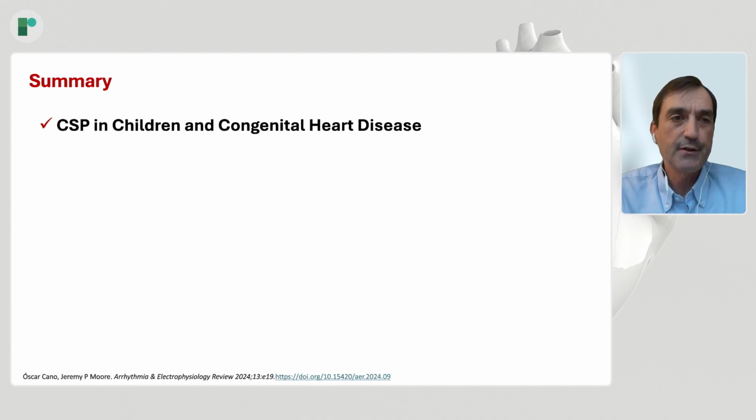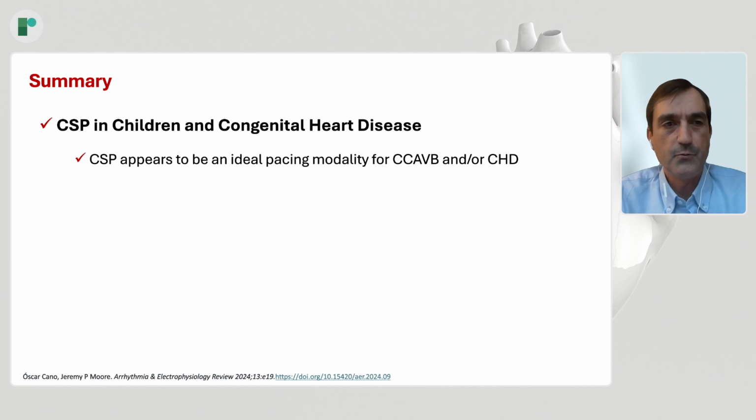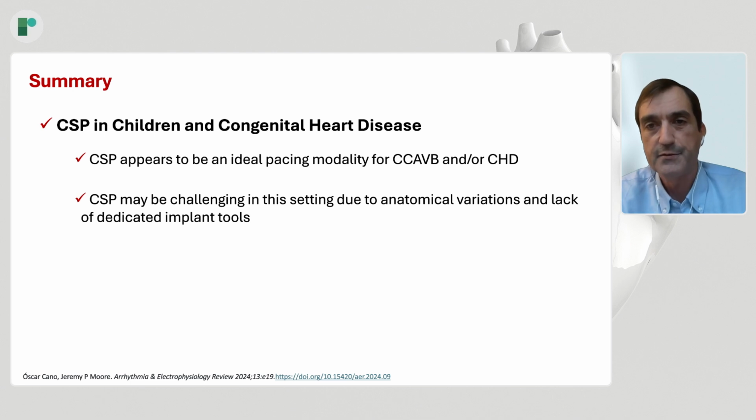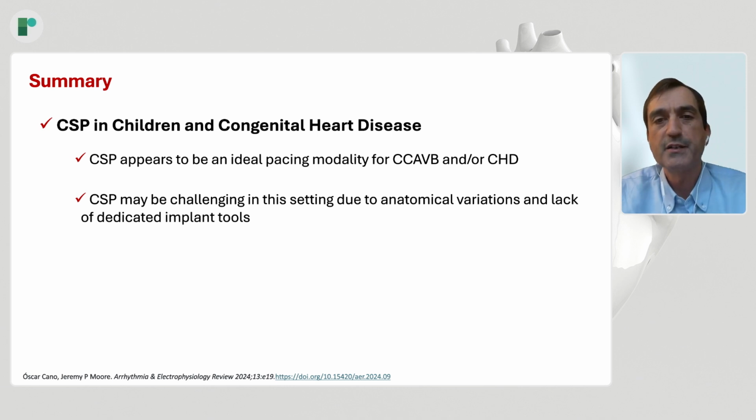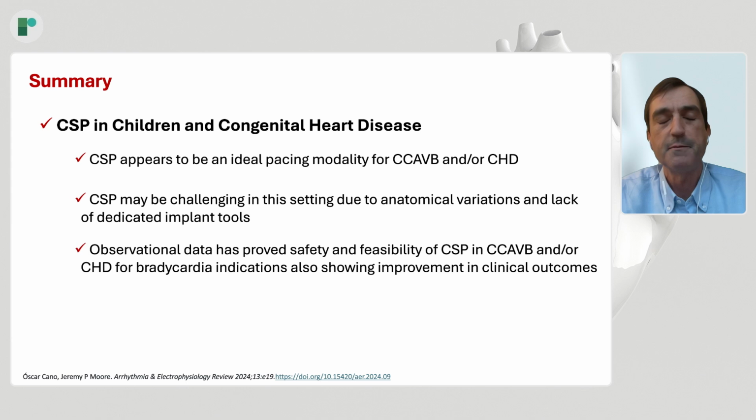With respect to conduction system pacing in children and congenital heart disease, CSP appears to be an ideal pacing modality for these patients, who have a higher risk of developing pacing-induced cardiomyopathy with conventional myocardial pacing. CSP may be challenging in this scenario due to anatomical variations and lack of dedicated implant tools.